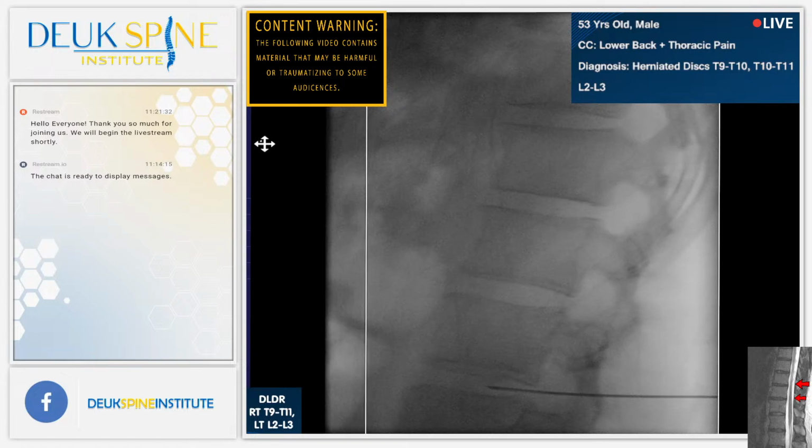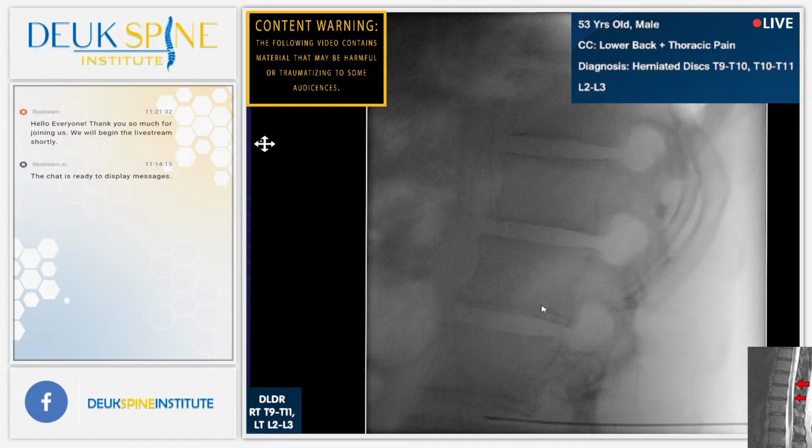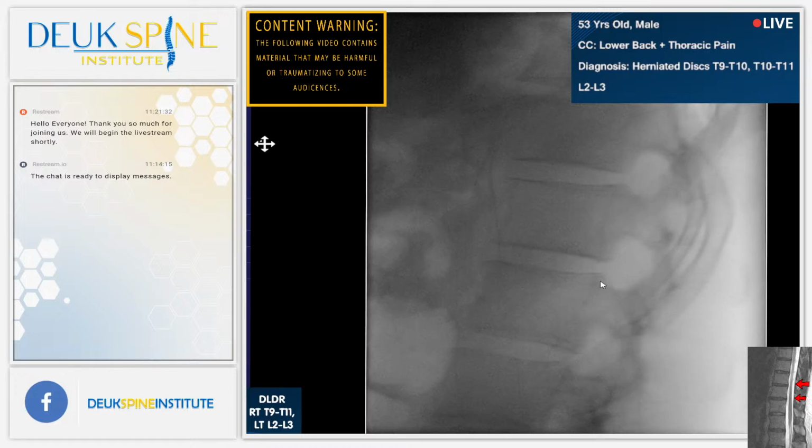So that must be 2. Show us 2. L2, L1, T12, T11. Just stay there at T11. Okay, so we know that's T11. And now we need to identify T9-T10, 10-11, correct? Yes, sir. Everyone agrees. So let's go up a smidgen so we can see 10-11. That's nice. Just go up a smidgen more. The smidgen of all smidgens. We just need to see the needle. Just the smallest amount. There we go.